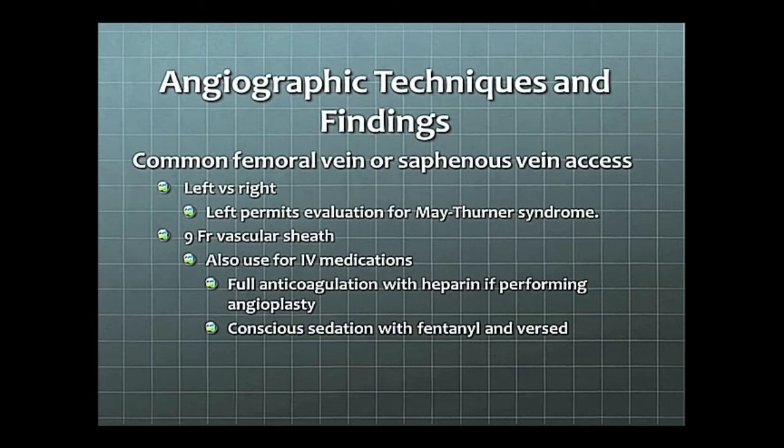Access can be via either the left or right common femoral vein. There's also some discussion of using the saphenous vein, kind of an interesting idea, using ultrasound to avoid injury to the common femoral vein. Either the left or the right can be used.